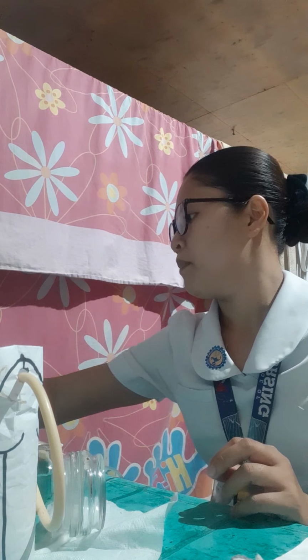Then, next, we are going to organize equipment for perineal care. Afterwards, we are going to position the patient correctly and cover with a bath blanket, exposing only the perineal area. For a female, dorsal recumbent position. For a male, supine position. Then next, we're going to place a waterproof pad under the patient.